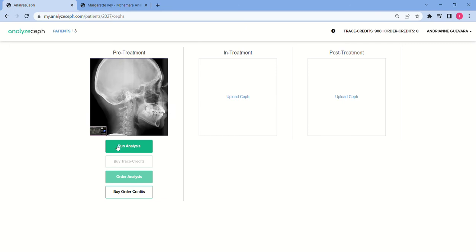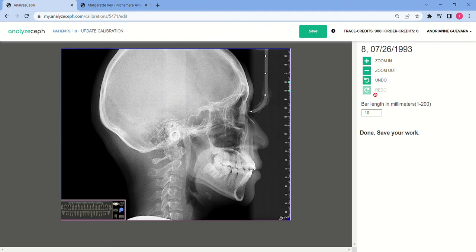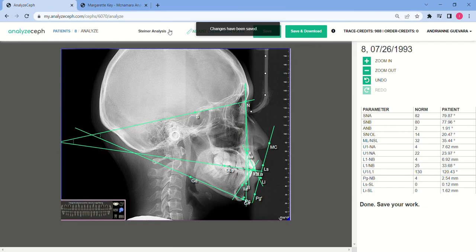Click Tracef and then click Run Analysis. Make sure that the calibration ruler is adjusted accurately. Make sure that the bar length in millimeters on your right side is the same as the one plotted on the radiograph. Here it's 10 millimeters and on your radiograph it's the same, 10 millimeters. Once you're done, click Save.